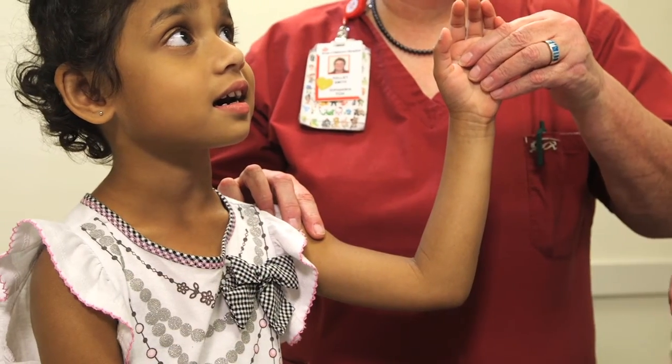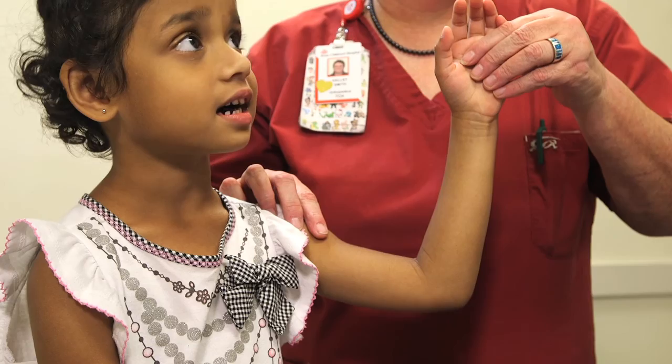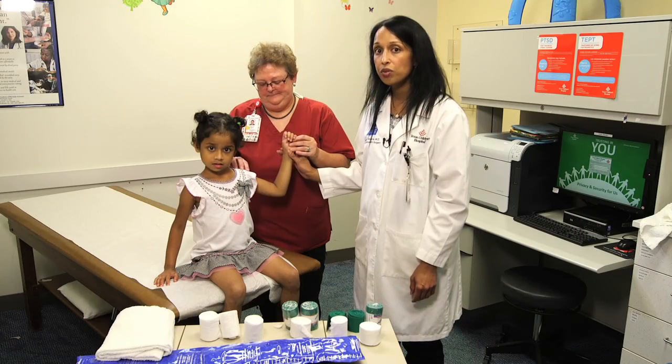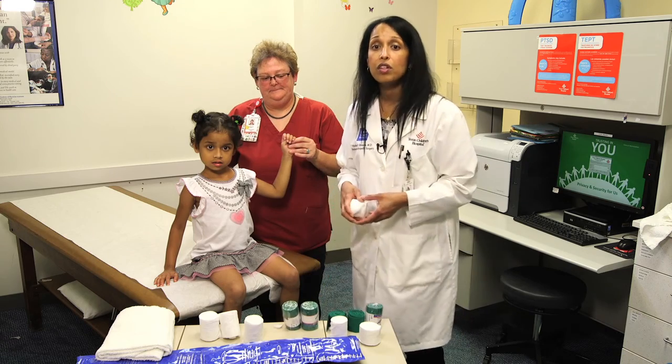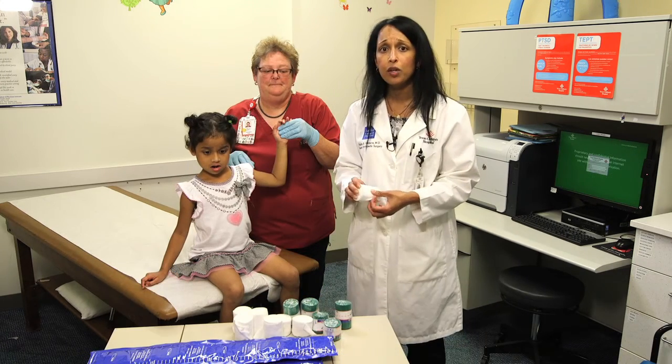When you have an injury of the forearm, you want to immobilize the joint above and below the injury — so the wrist and the elbow. That typically will involve a long arm splint. So first you're going to begin with measuring the patient.